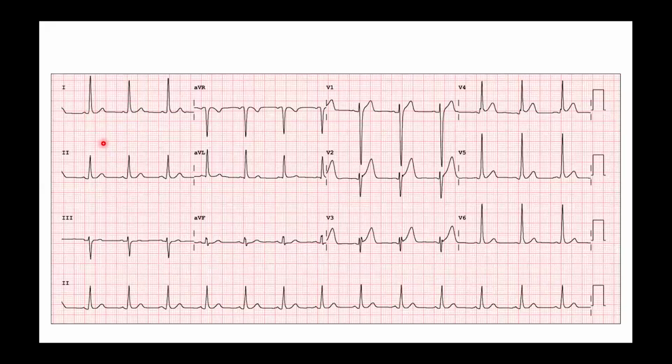What is the reason for the Q wave? Because of septal depolarization proceeding from left to right, you will see the initial Q wave in lead 1. What is happening with the atriofascicular pathway is that the ventricular insertion site will be in the anterolateral region. So it will not produce that Q wave in lead 1.